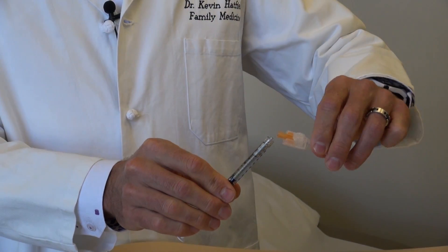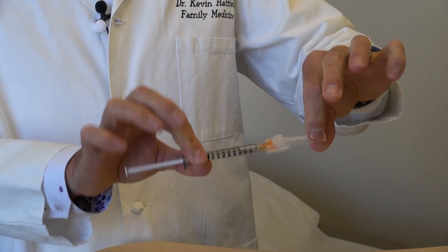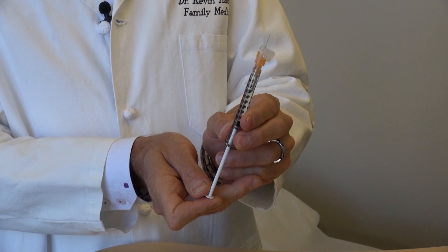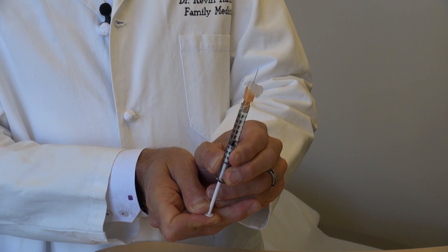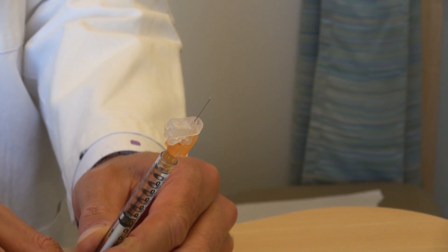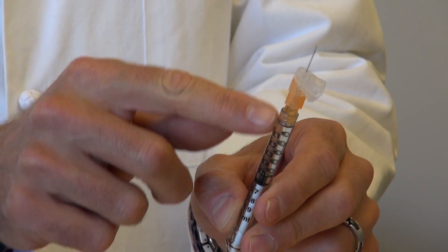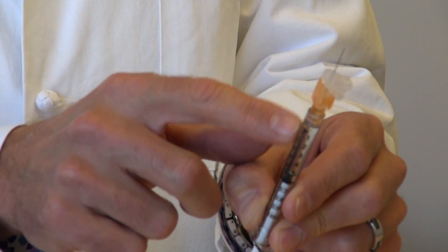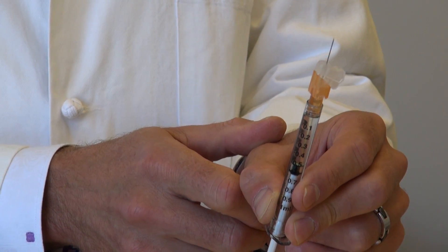Exchange the draw-up needle for the smaller injection needle, giving it about two-thirds of a turn to lock it on. Uncap it in one motion, then advance the plunger back up to chase out the extra air, priming the needle until you see just a little bit of liquid coming out the tip — a small ball of liquid at the end means there's no more air in the syringe. If you see larger bubbles in the liquid, tap the side of the syringe to chase them up, and go up and down with the plunger a couple of times if needed.